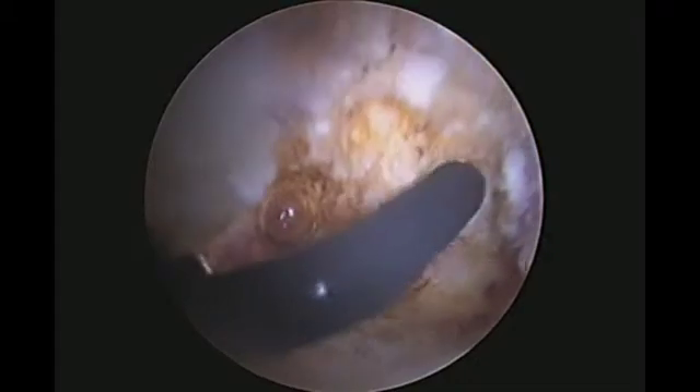Since the patient has intact joint surfaces, the decision was made to attempt labral repair instead of debridement.